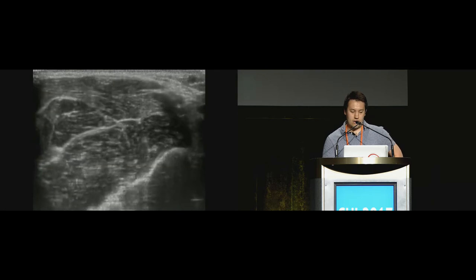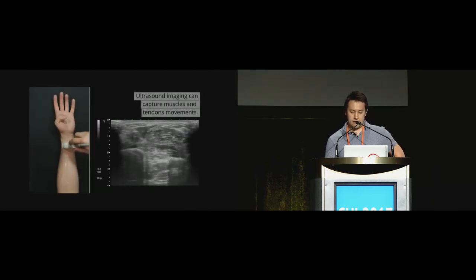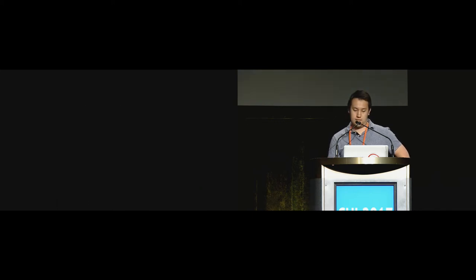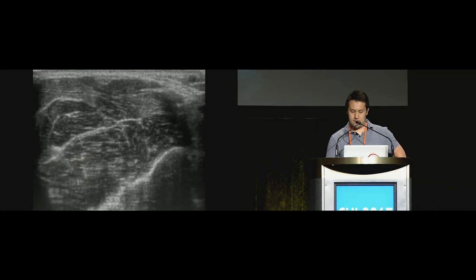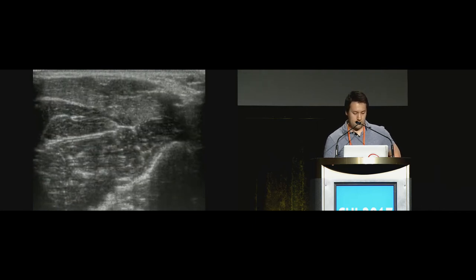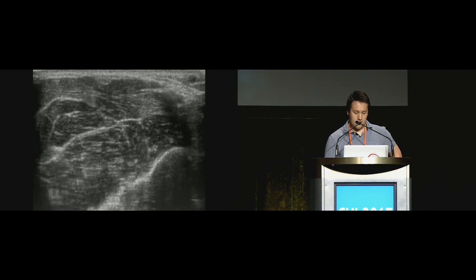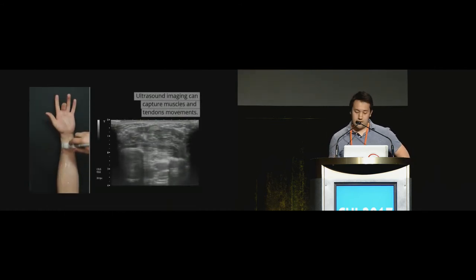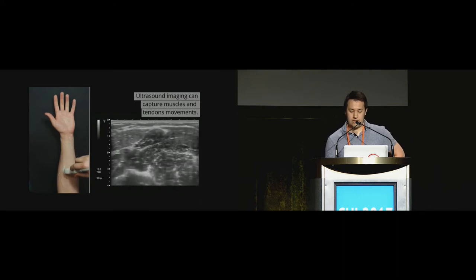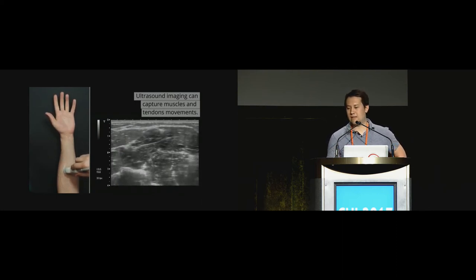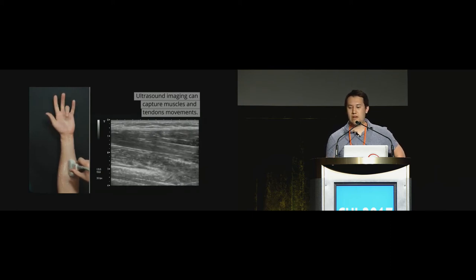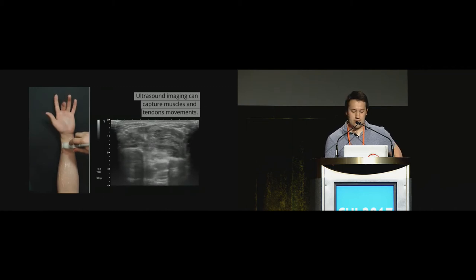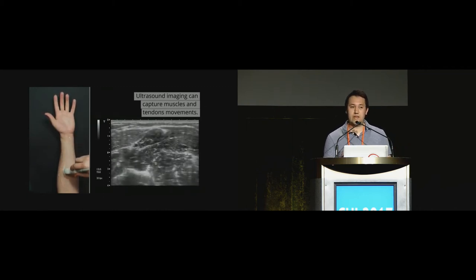Now here you can see the muscle fibres shifting around as the hand moves. I want you to pay attention to how different these images look in the different probe placements and orientations. The movement is especially different in the longitudinal plane as shown here as the fibres move in the direction of the muscle, as opposed to the transverse orientation here where the muscles and tensors kind of shift around each other and rotate.